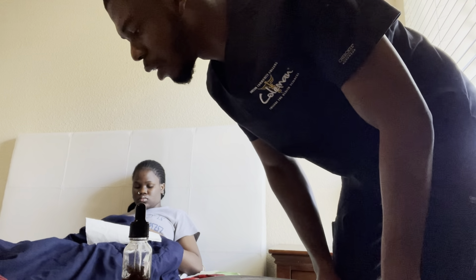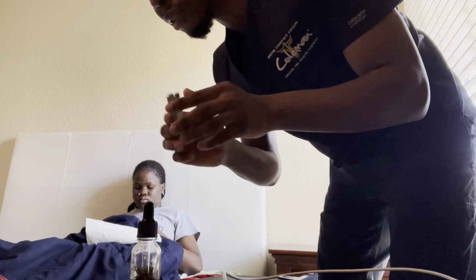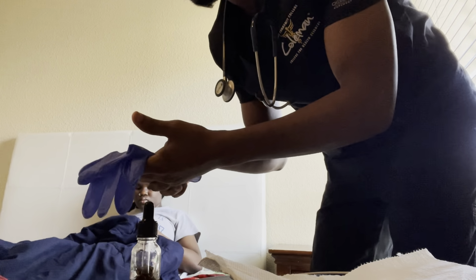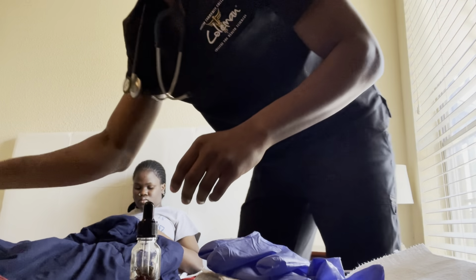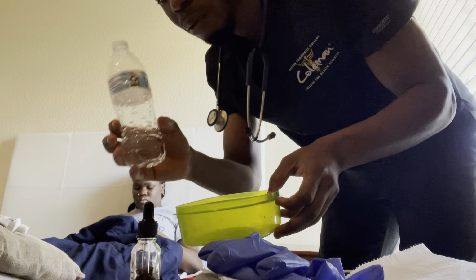The equipment needed for this procedure are basically my Yankauer catheter, my suction tubing, my pulse oximeter, my stethoscope, my drape, toothpaste and toothbrush to perform oral care, gloves, clean gloves, mask, gown, or face shield, an emesis basin, and a basin for water, and a normal saline right here.